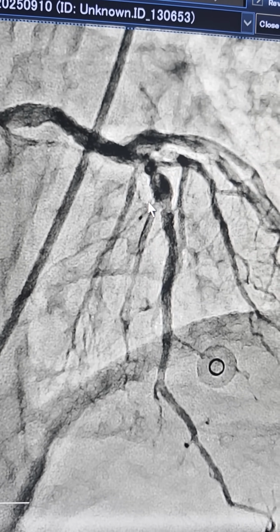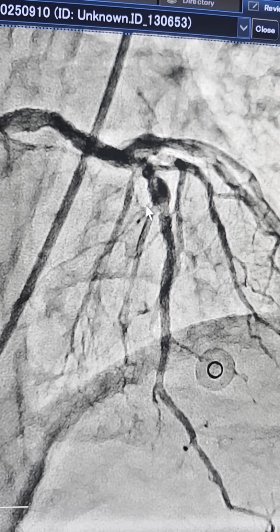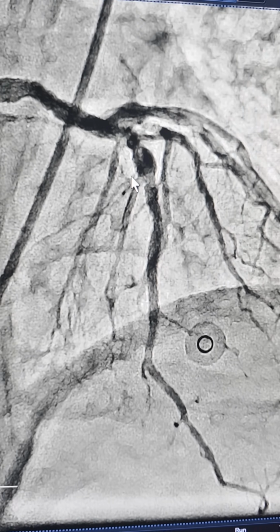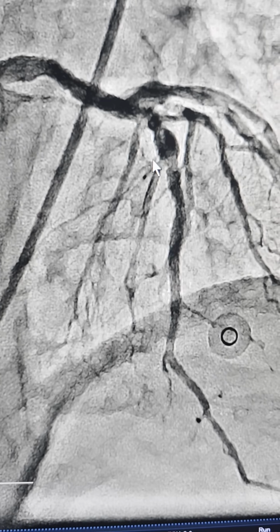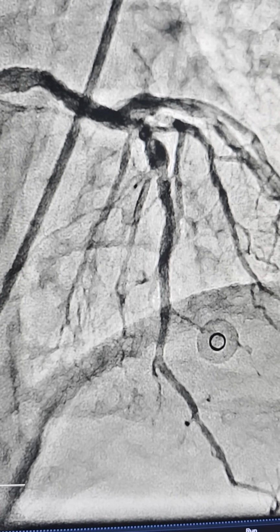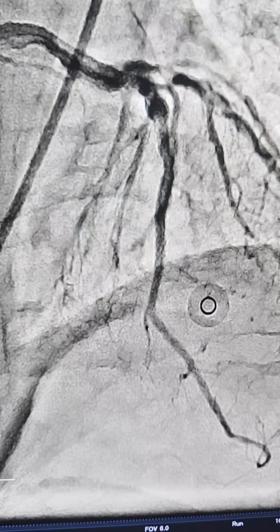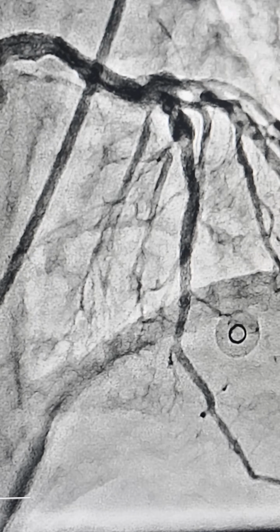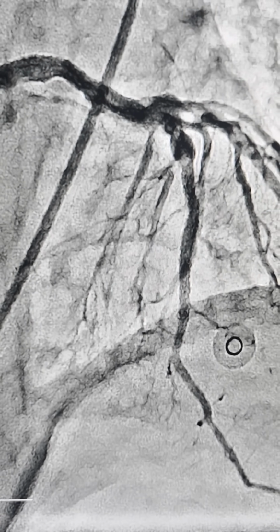I'll show you that pre and post, and his ECG has recovered. It's now 6 to 8 hours post. He's intubated, maintaining pressure on a single inotrope, and hopefully he will recover, God willing, if there is no new complication. But this is a case that I will remember, and everyone should take notice that no angioplasty, however simple, is simple, and you need to be careful with everything. So this is the final result, and let's hope this patient remains well long term.